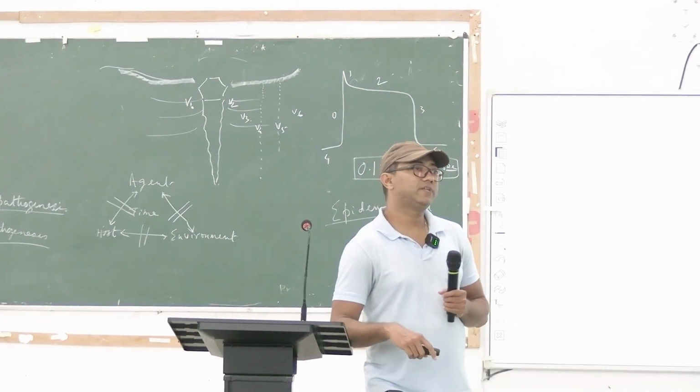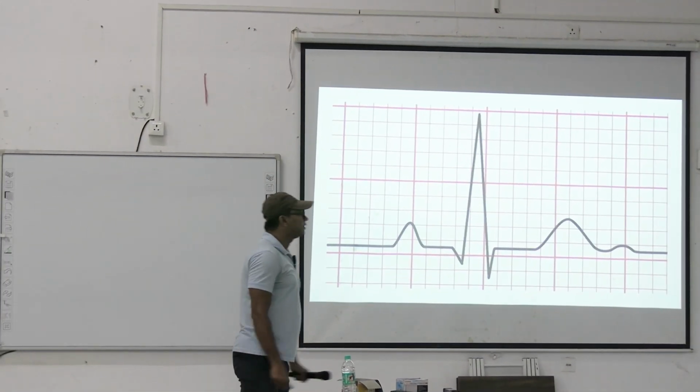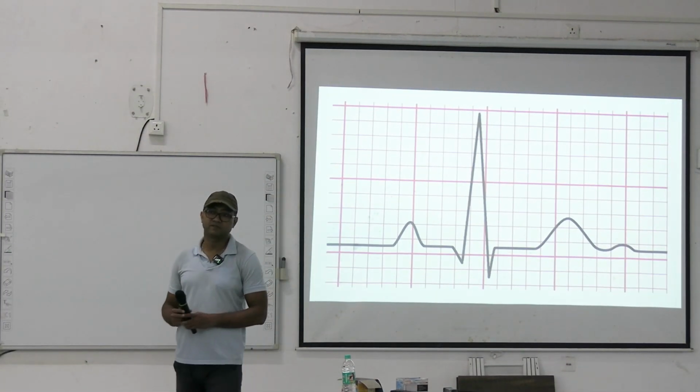Okay. Now, the duration of QRS complex, duration of QRS complex.